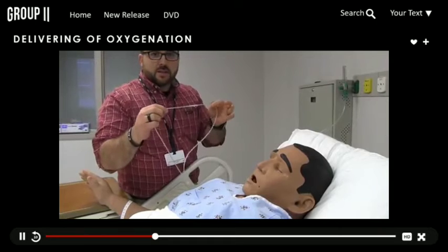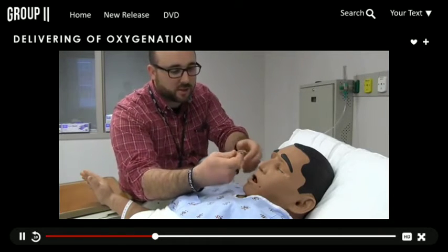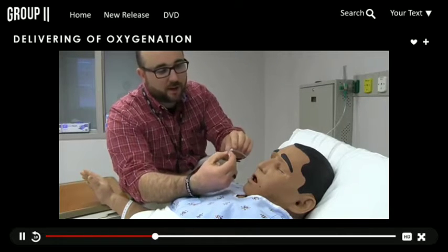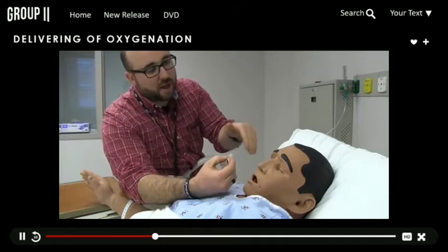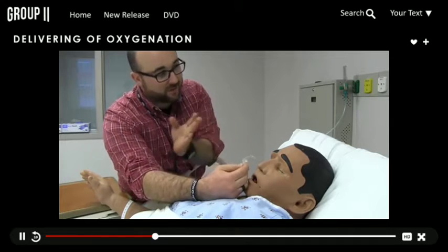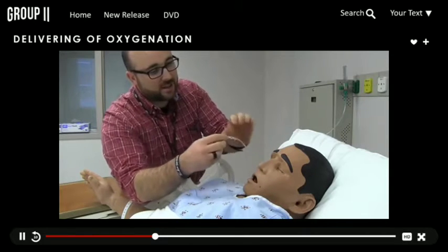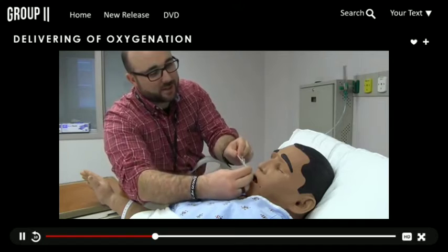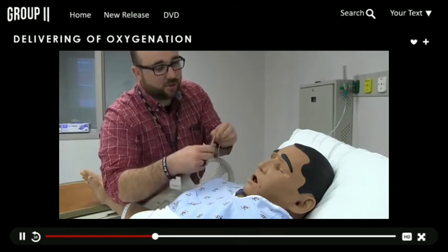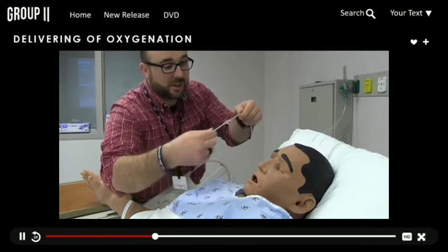Alright, so now I'm going to apply this to the patient's face. You're going to notice that there is a little bit of a curvature to these cannula prongs. What you want to think about is these going in and following the path of the nasal cavity. The nasal cavity does not go up, it goes back and around. So these always curve back like this. If you put them on backwards, it's going to oxygenate the epithelial cells on the inside of their nose, but not get down into their oropharynx, down to the lungs where you really need it.